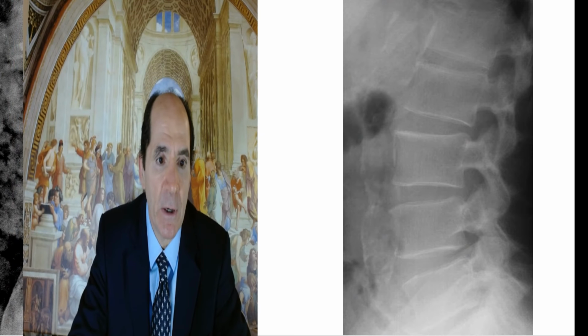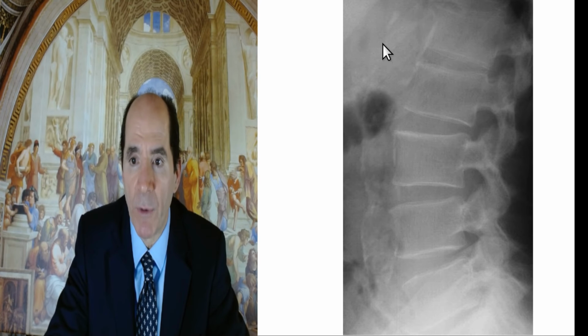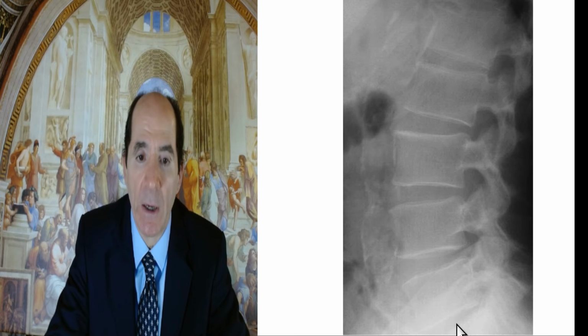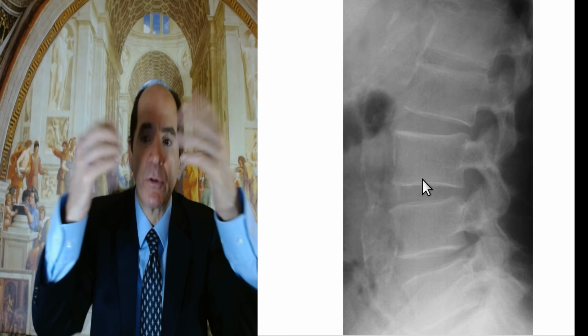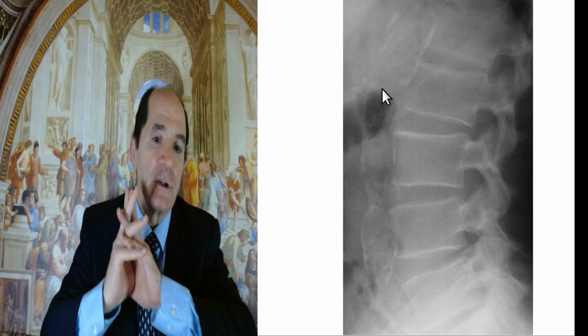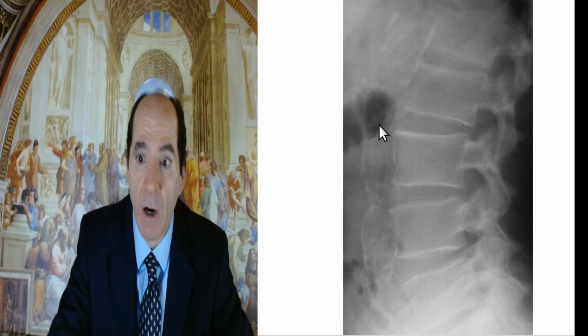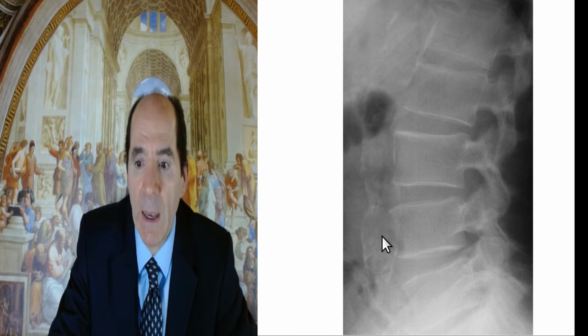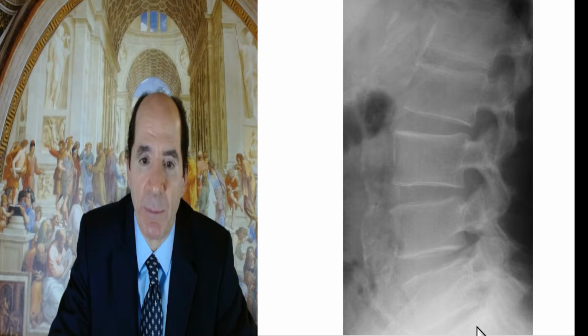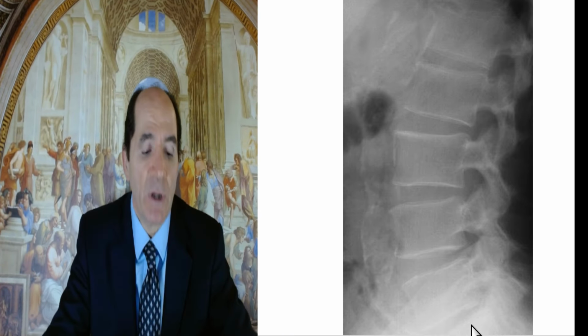This patient over here has calcifications of the aorta from atherosclerosis. They've got a little L5-S1 disc space narrowing. So this is a patient further down the path. And if they've got atherosclerosis in their abdominal aorta, it's a great bet they've got pretty significant coronary artery atherosclerosis in their heart. Okay, and they're headed towards a rapidly progressive worsening of their spine. So what I'm saying is these are predictors of the age of the patient.